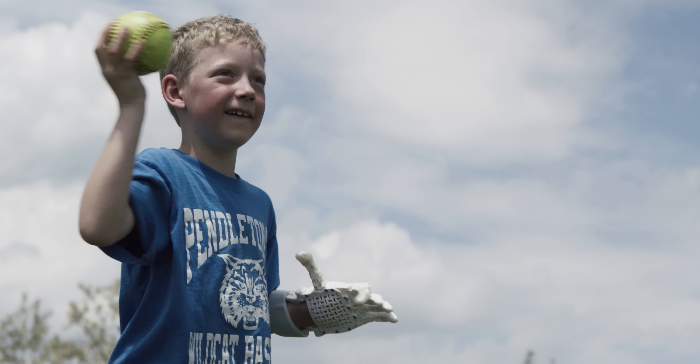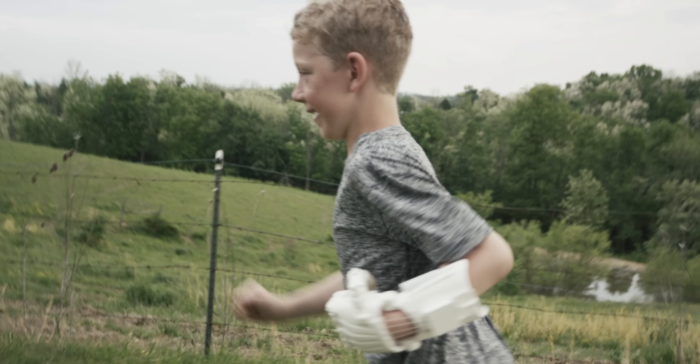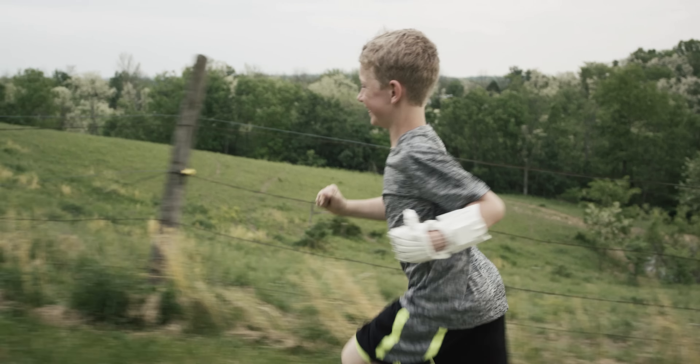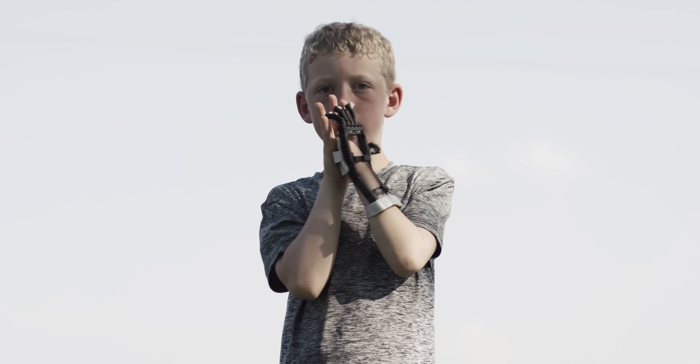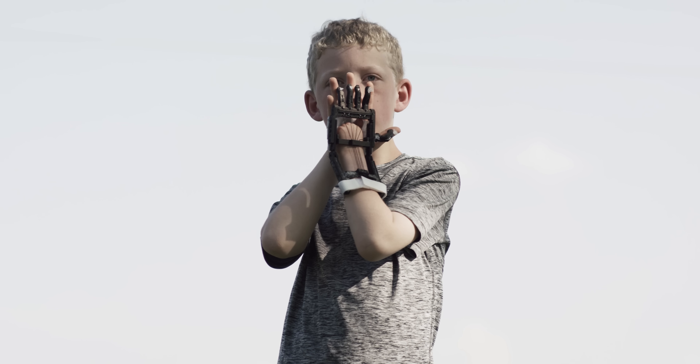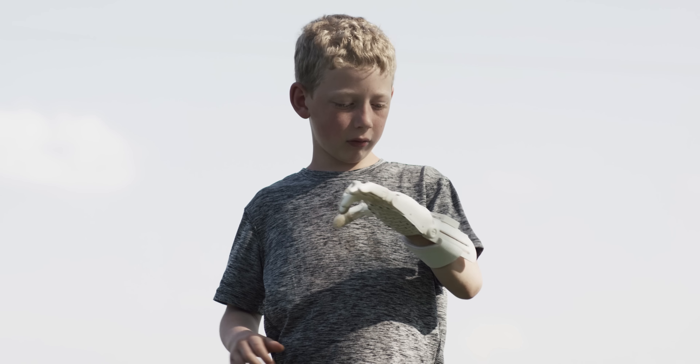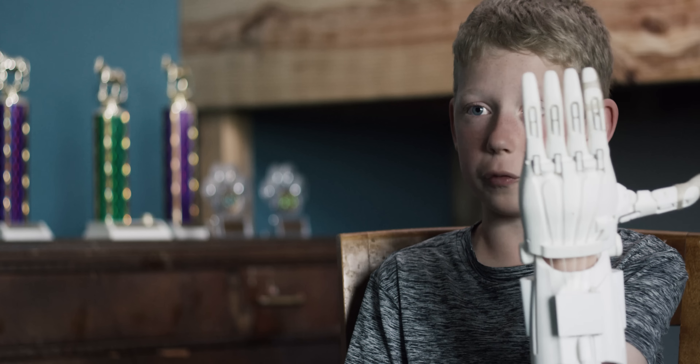It doesn't hold him back. I have my first hand that my dad made, my second hand, my third hand, my fourth hand, and my fifth hand — which is this one.